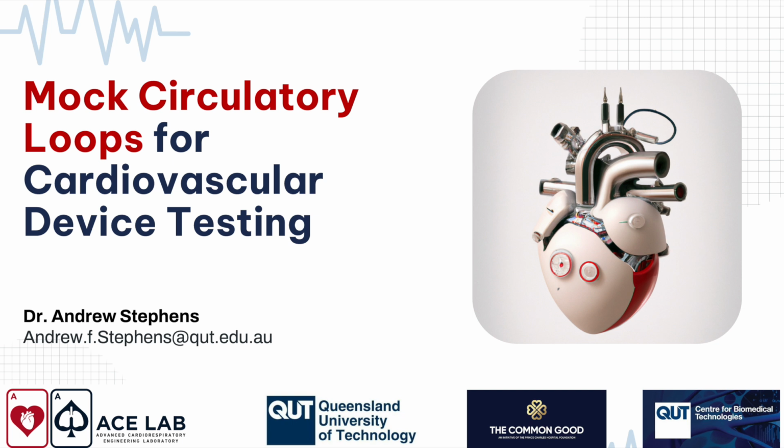Here you can see a nice polyurethane valve that we have in our mock loop. It's got about a 3 to 5 millimeter of mercury drop between the left ventricle and the aorta. These old umbrella valves that we had were closer to 15, 20, which is way too high.